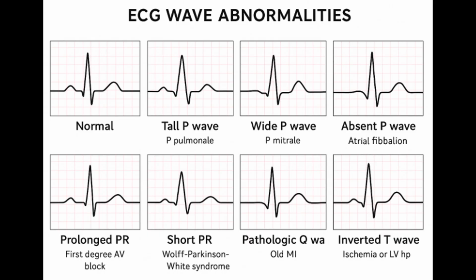Okay, so P waves gone, QRS widening. And eventually, if it's not treated, the whole thing can degrade into this smooth, undulating sine wave pattern, which is basically pre-arrest. It's incredibly dangerous, requires urgent treatment, usually IV calcium gluconate right away to stabilize the heart muscle cells. Wow, just an electrolyte shift causing that. Yeah. Terrifying. Okay, what about the other end?